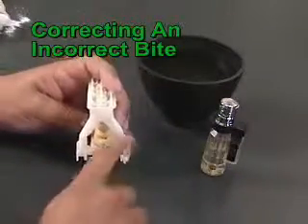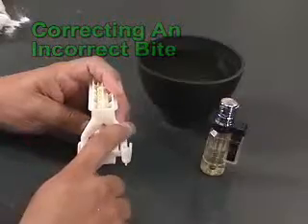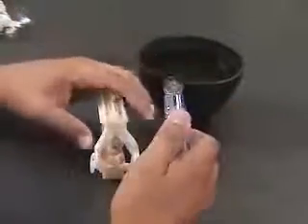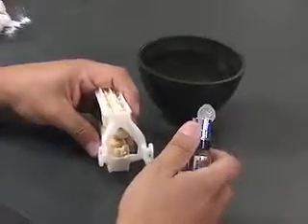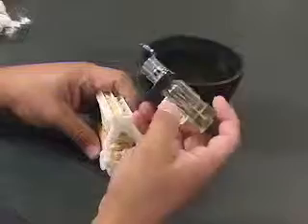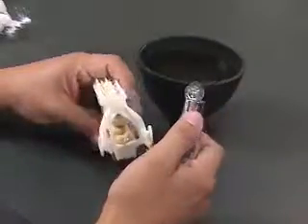An easy way to correct an incorrect bite is to quickly heat up the arms with a mini torch or cigar lighter. You can pick up one of these in any cigar store at a small cost. Quickly heat the arms till the heated area gets shiny but not burned.